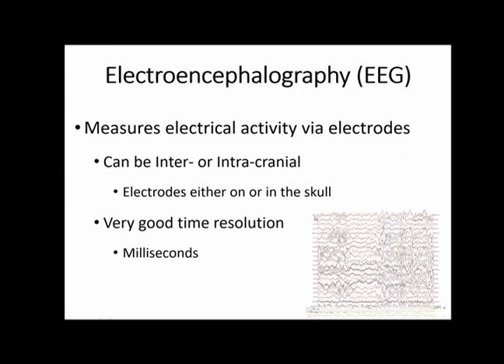If you think of it, each line here, if we start at the very top, this line is one electrode, and you as the researcher would know where each electrode has been placed. So maybe this one electrode at the top has been placed on your right temple. And then the one below that would be placed a little bit above that, and the next one above that.